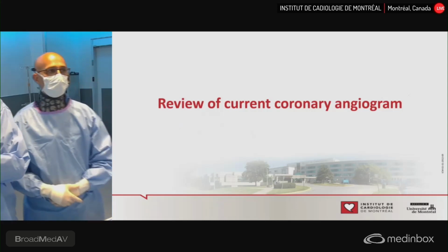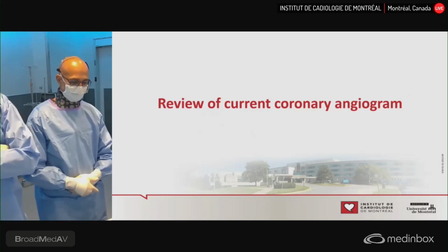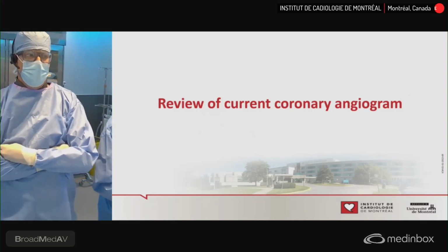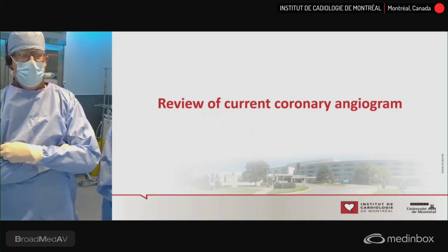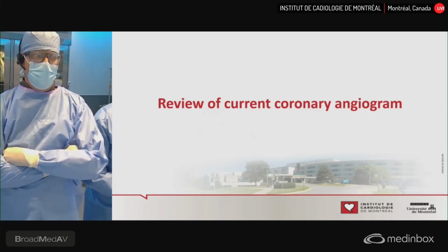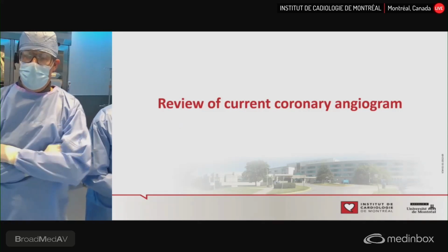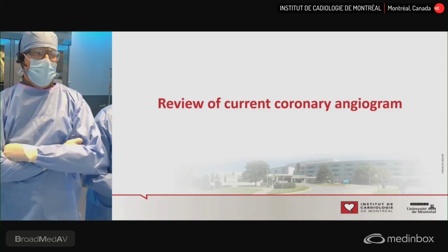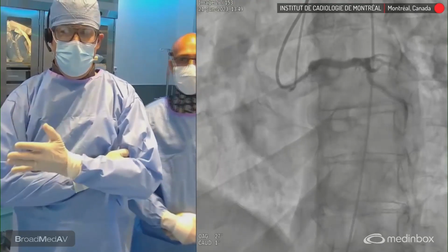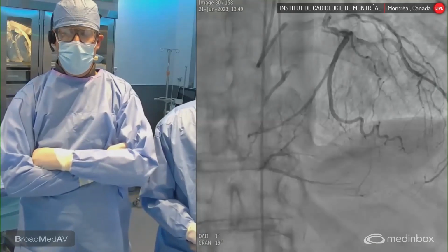We'll now review the angiogram, and I'll let Philippe take over here. Sure. The angiogram is being performed exactly as Dr. Nosser mentioned. We have the injection first in the left system, which is the donor vessel, and then after 1 or 2 seconds, injecting the right. Hopefully, we can have this angiogram up on the screen. We can see, again, the left system injected first. Then, of course, after 1 or 2 seconds, injecting the right, we see both vessels.